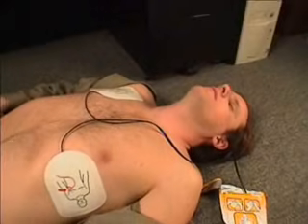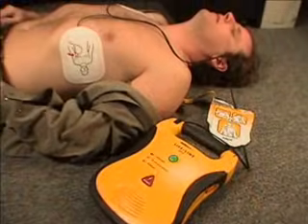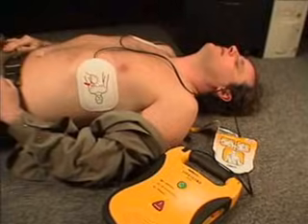If no shock is needed, the unit will announce: No shock advised. The Lifeline AED will not shock a victim that does not require a shock.